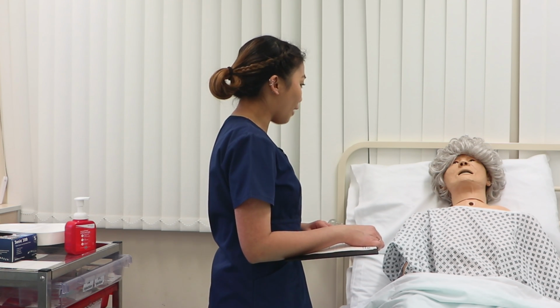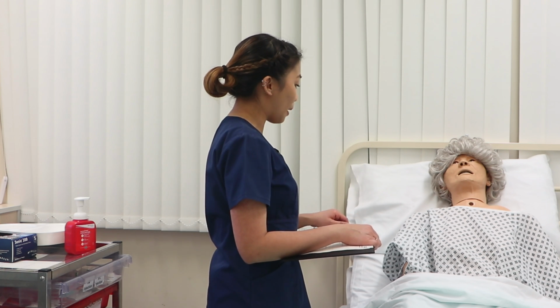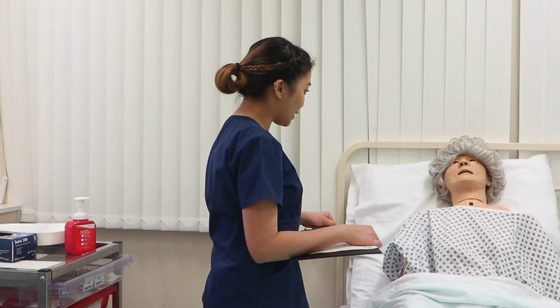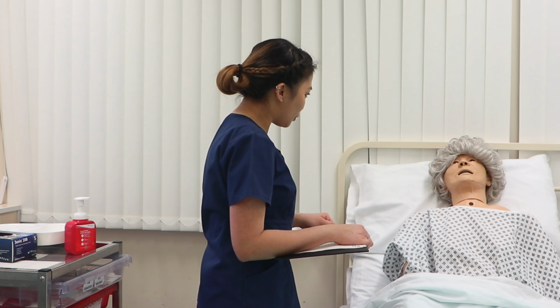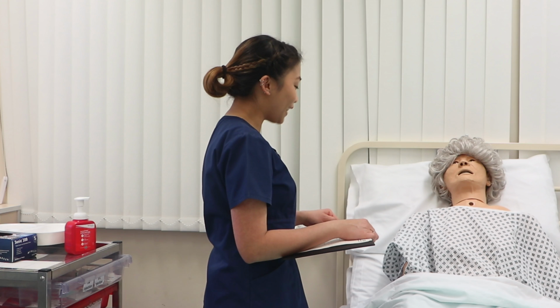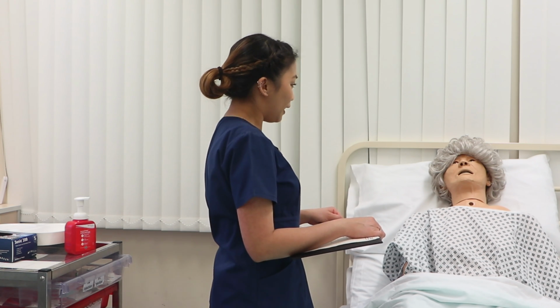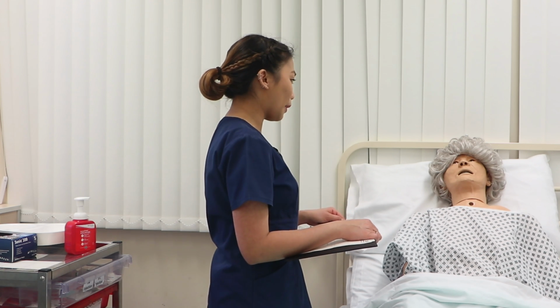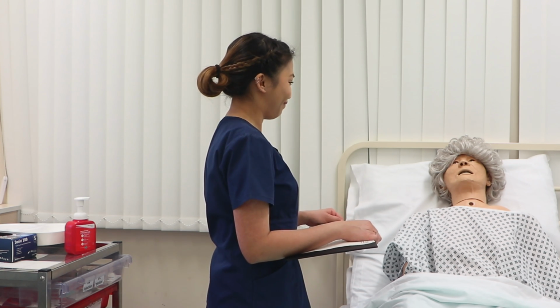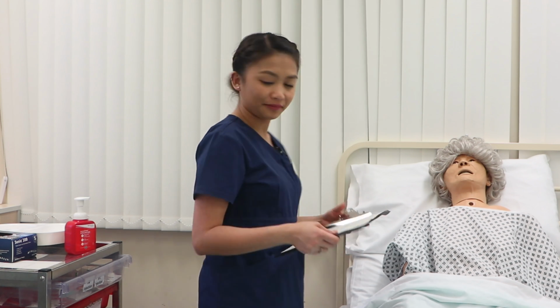Where do you prefer to have it now? Alright, that's good. Okay, I will give it on your upper arm. Do you prefer it on your right? Is that alright? Okay, that's good. Emma, is this the right time to do it? Alright, and are you happy for me to do it? Okay, thank you, Emma. Can you just give me a minute? I'll be just in the other room and I'm going to prepare our materials and the medication. Alright, thank you. Just give me a shout if you need anything.